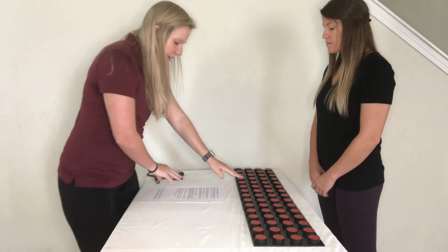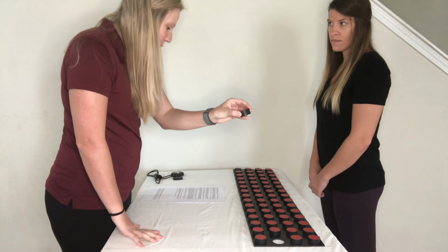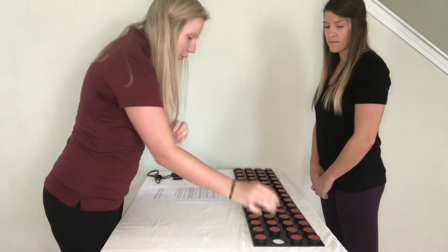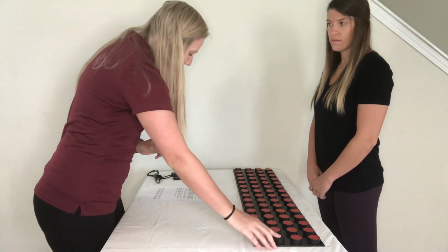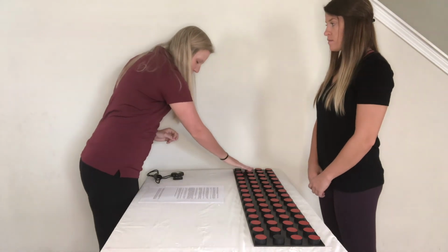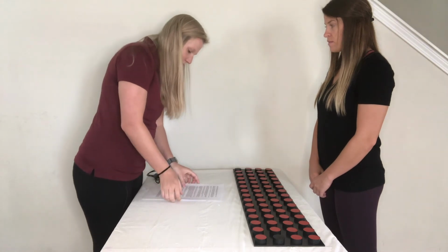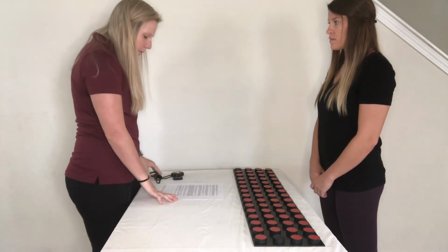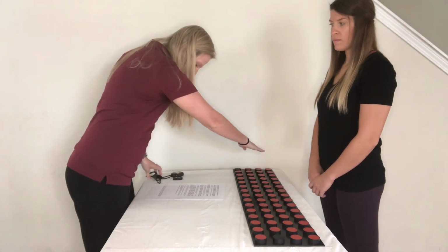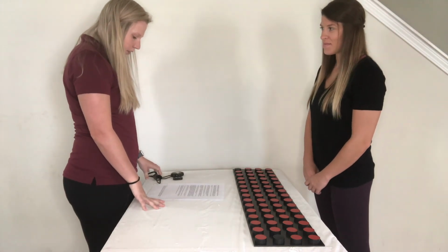You must work to your left across the board on the top row. Now with your right hand, you pick up the first block in the second row, turn the disc while passing it to your left hand and returning it to the original hole with the bottom side facing up. You will work to your right until you complete the entire row. As you work back to the left in the third row, you will use your left hand to pick up the disc and your right hand to return it back to the original hole. Working back to your right on the fourth row, you will use your right hand to pick up the disc and your left hand to return it.